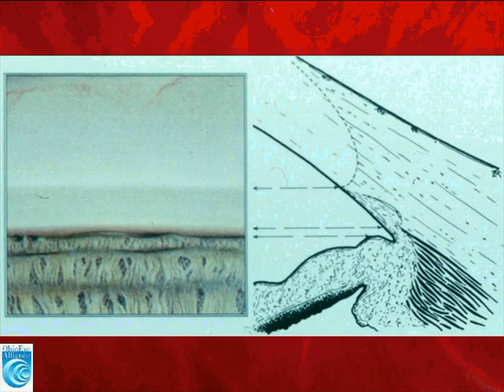If we look at this image, we can see an image of trabecular meshwork where there is very little pigmentation, and we don't have the corneal wedge in this case to help us, but luckily we have a nice anatomic drawing next to us. We can see that the trabecular meshwork in this case is light gray, almost bluish looking.